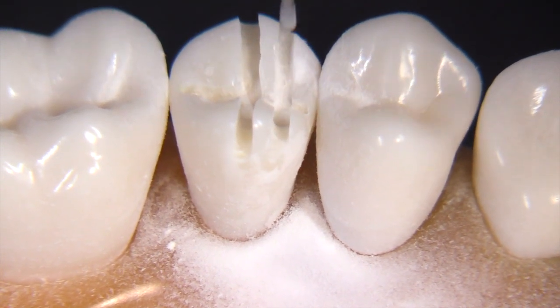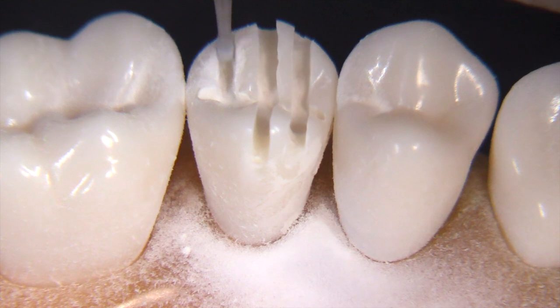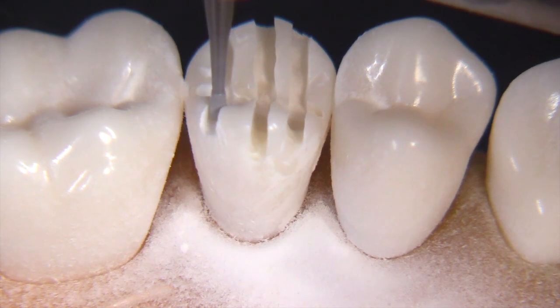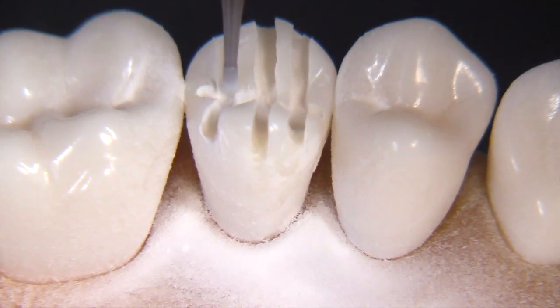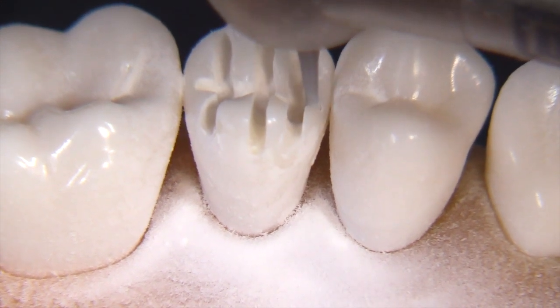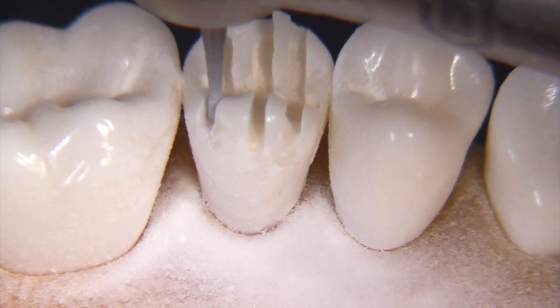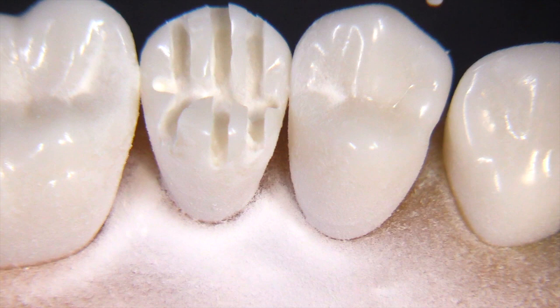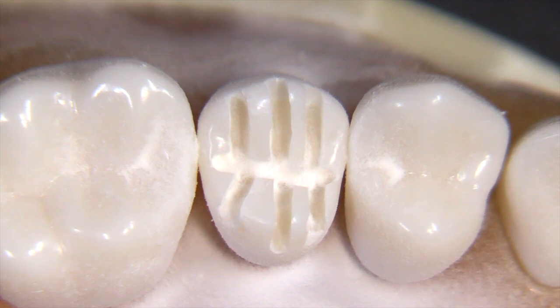Sometimes as you're going up a ridge, or perhaps not looking at it from the right angle, you may be a little bit shallow. You'll notice here that the mesial slot is a little more shallow than it should be. So on inspection after making these slots, we'll go back and improve them, making them all at least 1.5 to 1.6 millimeters. Alternative techniques like utilizing a diamond burr on its side can work, but this is very convincingly successful because we can prove it's 1.5 millimeters.